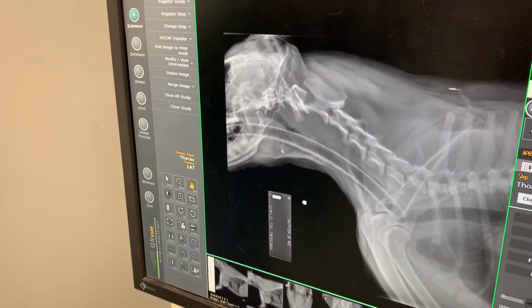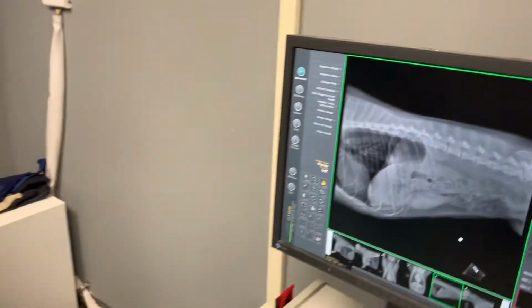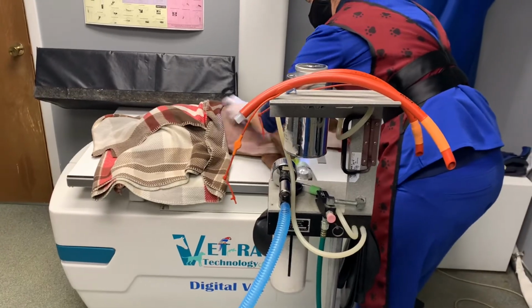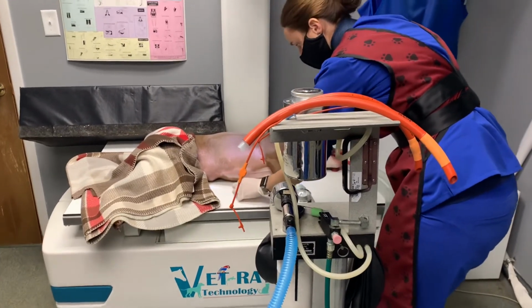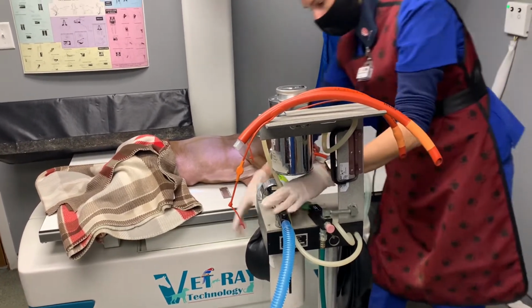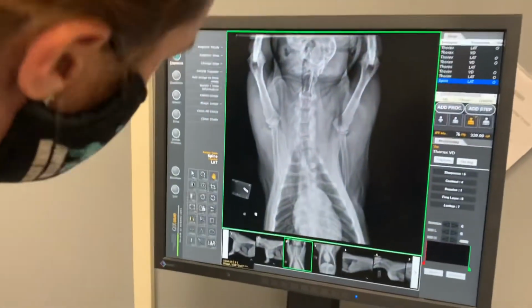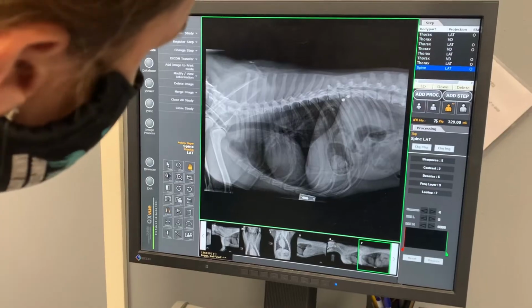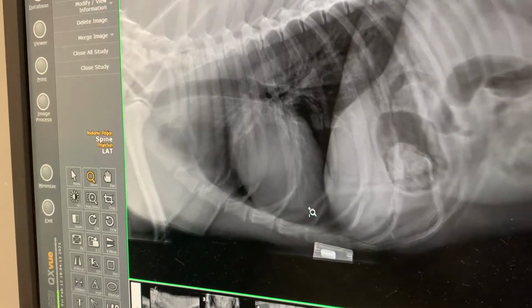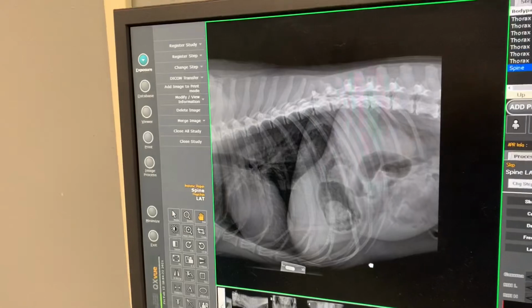Hopefully now this girl will do well. There was a little suspicious area on her stomach with the previous film, so we're going to shoot that again just to see what we've got since she's asleep. Does have this in here. You can see that a little bit better. It looks like a little ball of something. So this she may or may not be able to pass on her own. So we'll talk to her owners about that. And I think at least at this point in time we're going to wake her up from this and see what it is that they want to do.